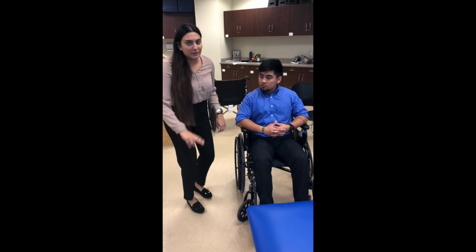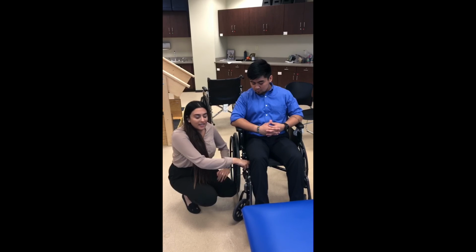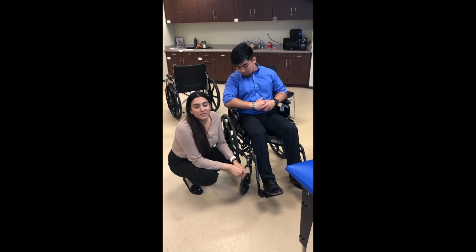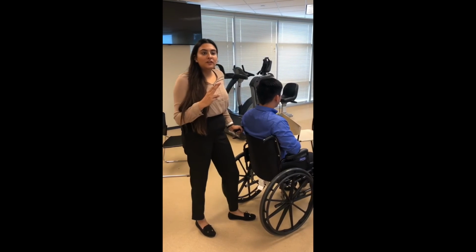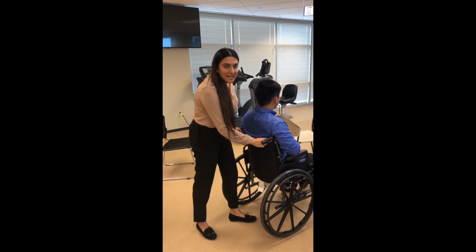So in order to do that, we're going to put 2 fingers horizontally in between the front of the seat and the distal thigh. Next, we're going to confirm leg rest length. So in order to do that, we're going to take 2 fingers vertically underneath the foot plate and the floor. Lastly, we're going to confirm back height. So in order to do that, we're going to put 2 fingers vertically in between the back of the seat and the patient's axilla.